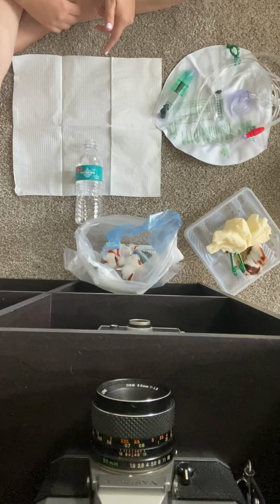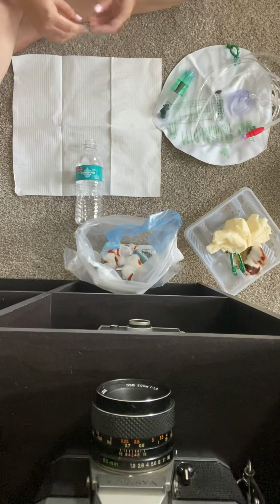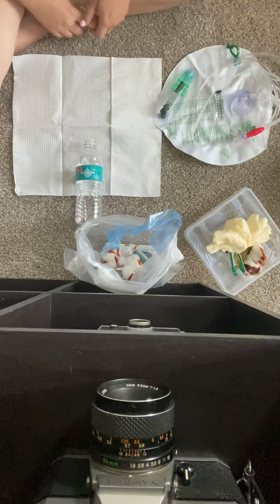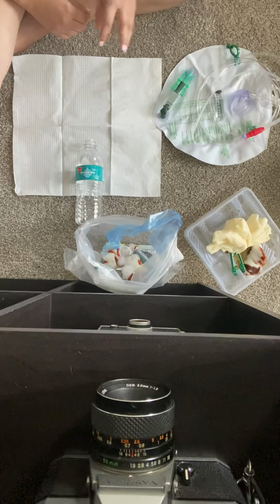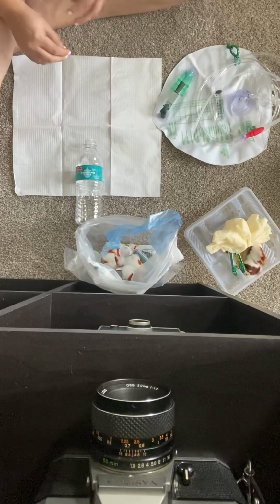And then what color is it? Does it have any sediment, any hematuria, anything like that? You would want to chart that. So that was my insertion, and now I'm going to document my removal.